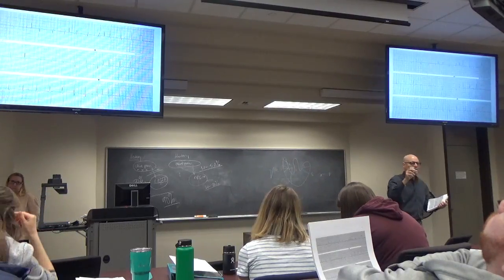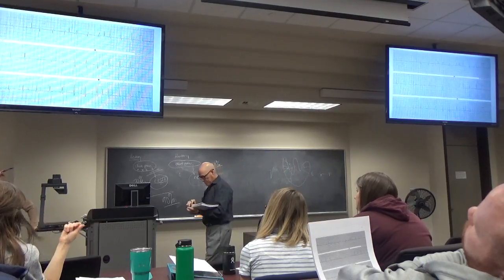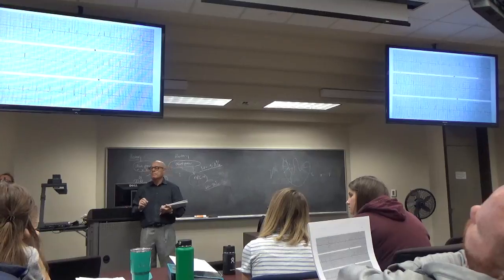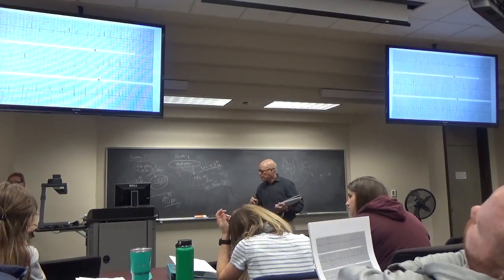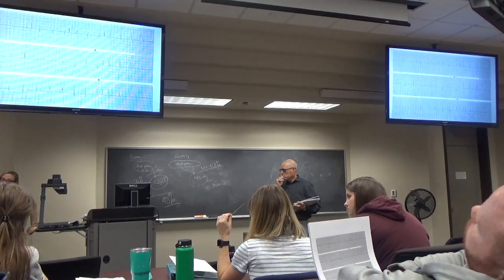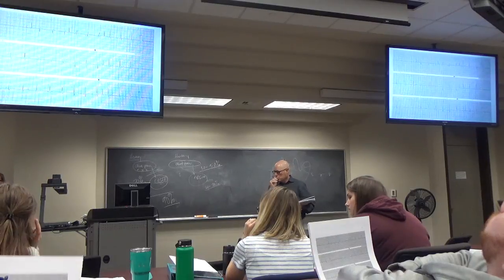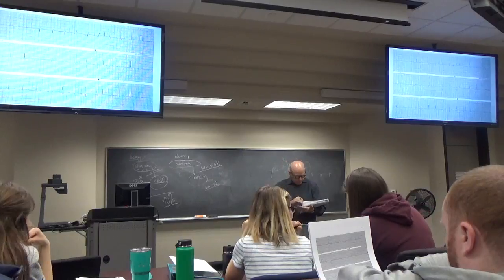I see what she's saying, though, because at first we were saying that the very first deflection off the baseline, if it goes negative, is a Q wave. But what you need to do is look for P waves first. And if they're throughout the EKG mostly, but then the area that you're concerned with is down first, then that, and then it looks like a Q here, I could call that a P wave, not a deflection of the QRS complex. So if there were no P waves, it would make it harder, but there are P waves throughout the rest of the EKG.